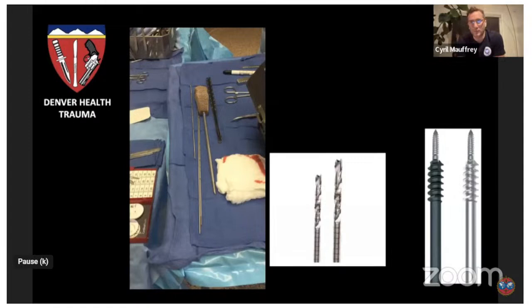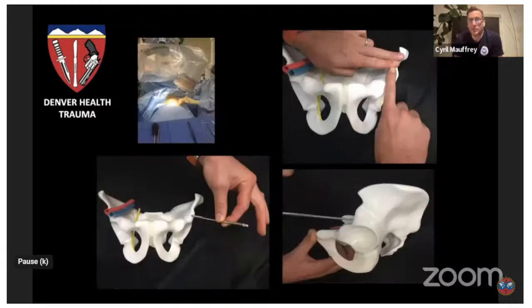For this case that I showed you earlier, you will remember that the fracture was from the medial to the lateral plane, which means that a screw that would be efficiently capturing that fracture would be, for example, an LC2 screw. You saw Ramesh's talk on this earlier. It's very hard to get the entry point of an LC2 screw with the X-ray. The textbook tells you that the entry point is determined on an obturator outlet.